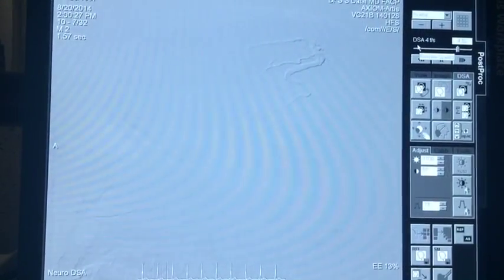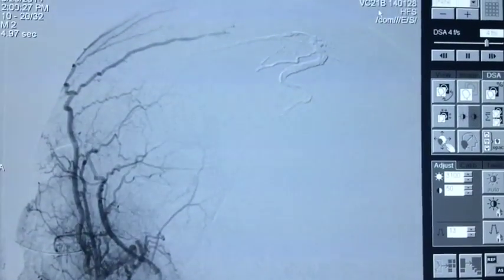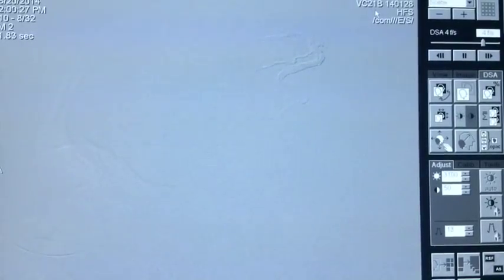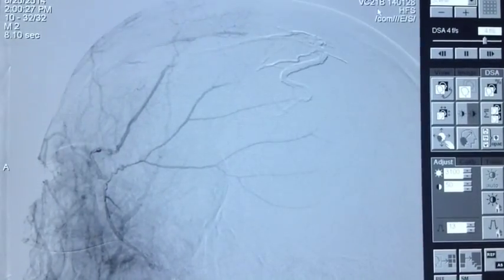We can see there is absolutely good control of this fistula, complete cure of this fistula with a good Onyx cast. And now we can see the fistula is not filling at all. It is completely embolized. Part of the vein, the fistula, as well as part of the artery is taken care of. This is how we embolize this lesion.